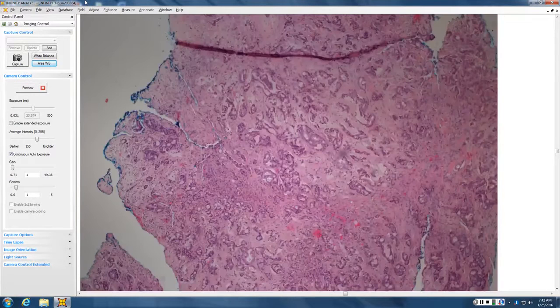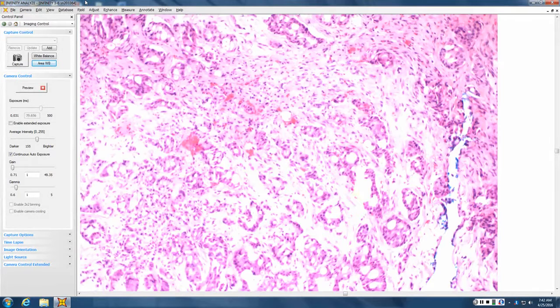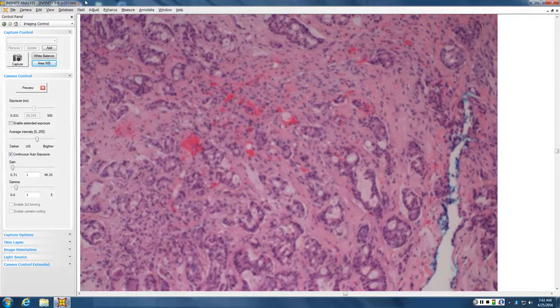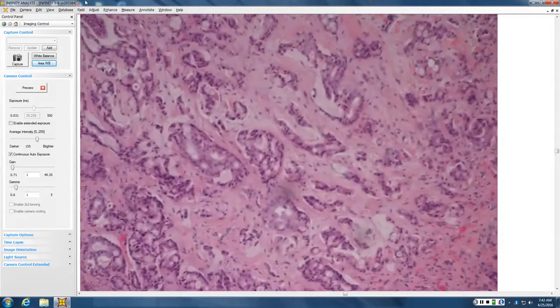This one is another adenocarcinoma. You can see the little microcystic pattern, little pattern of ducts throughout. This particular one was pancreas origin. It helps to have a little mnemonic, because you have a few that are either double positive or double negative with the keratin 20. So, having a little chart.